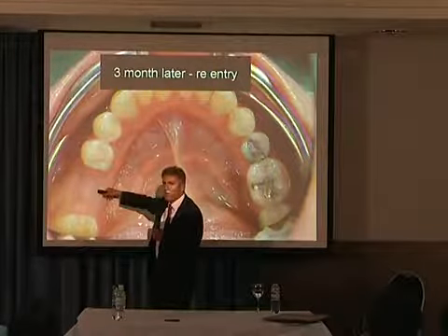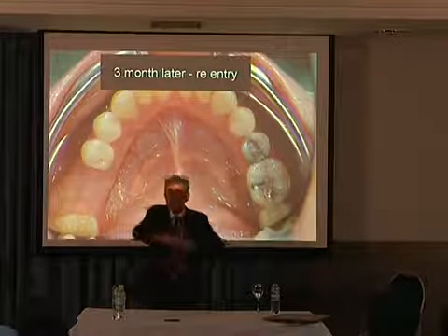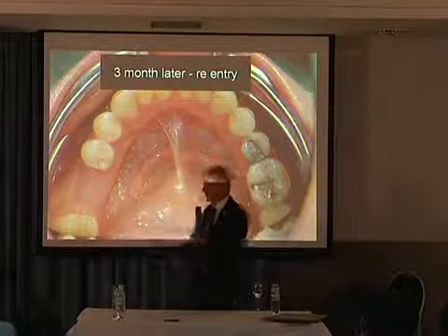Small incision. Big gingiva former to form the tissue, not to destroy it.